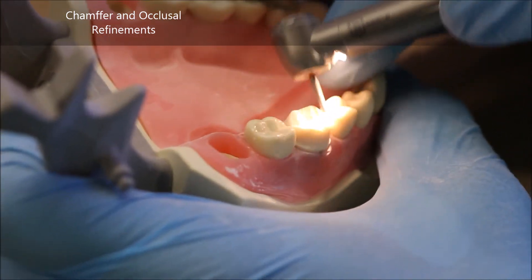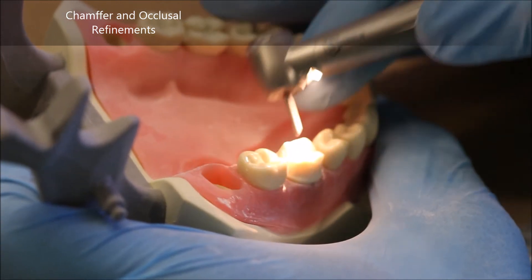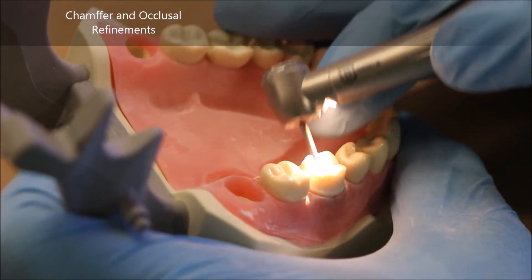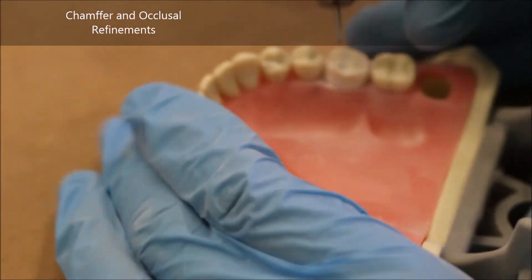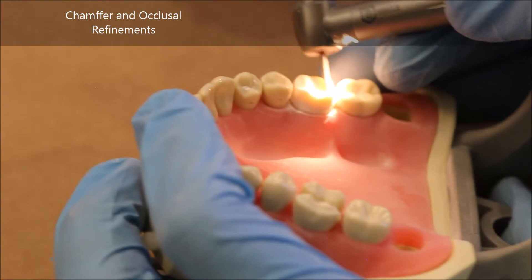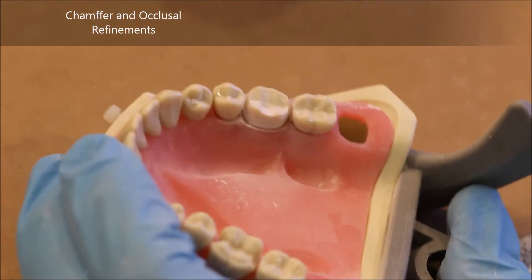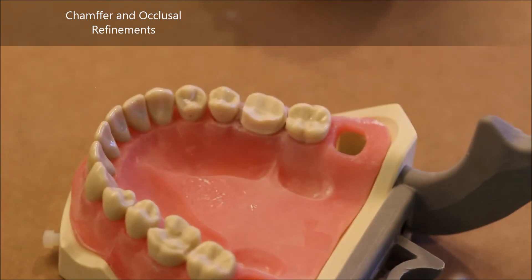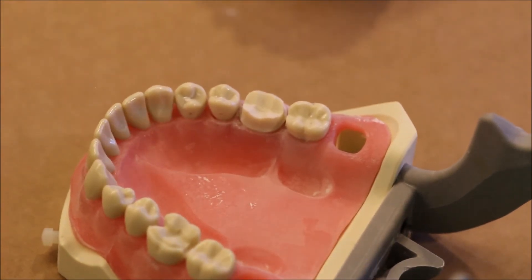I switch over to a very fine diamond burr known as the 8877. It's a parallel diamond burr with a round end, and what it does is let me remove any sharp corners in my occlusal table that were created because the 57 burr we used initially can leave a lot of really sharp features in the prep.